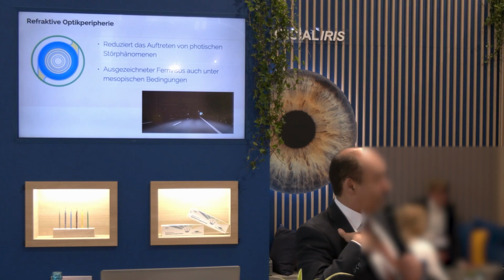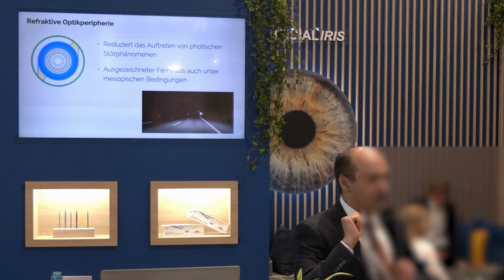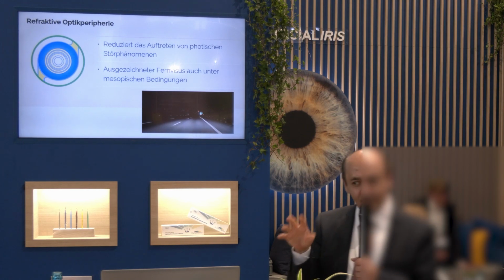That is, if I were to wish for a lens, I would wish that it would become completely monofocal for distance at night, with the highest light output for the distance. And as soon as I have light, it becomes completely multifocal for close. That's how I would like it to be. Yes, and this wish is actually largely represented here.